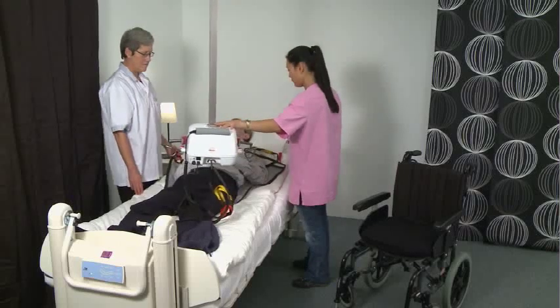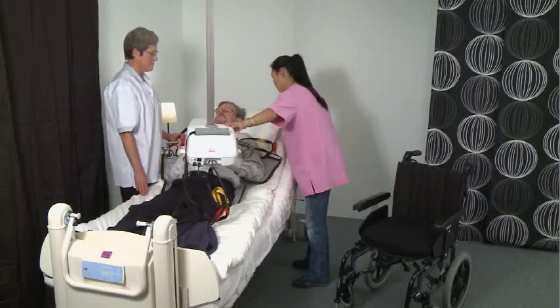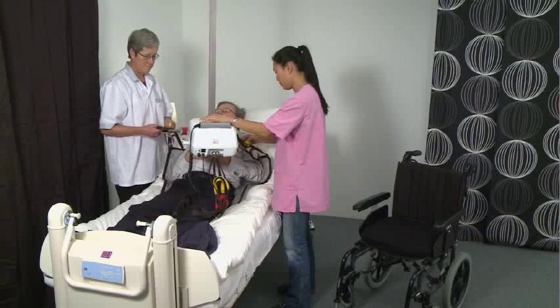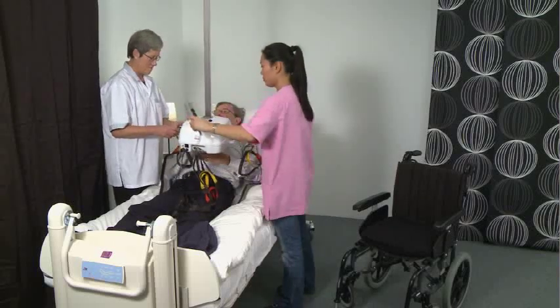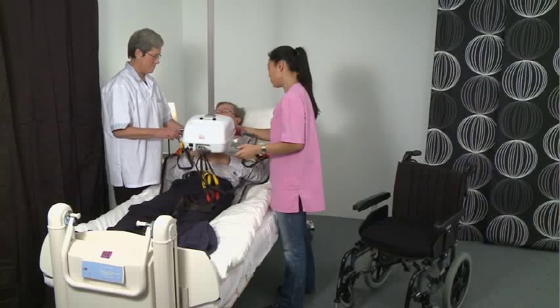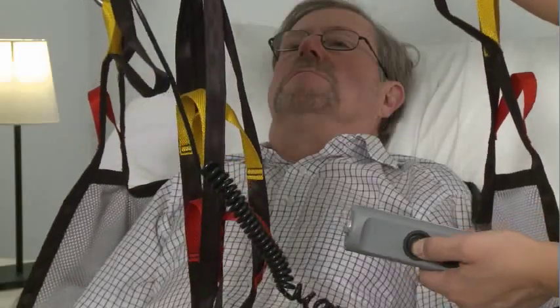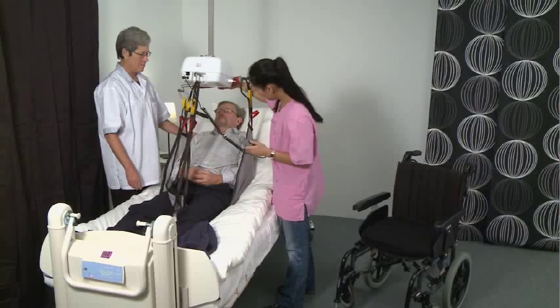Adjust the bed height and raise the bed's back support for a more comfortable lift. Hook the back harness strap loops into the corresponding hooks on the hoist unit. Hold the hoist unit away from the client's face while you gently raise it. Stop when the straps are tensioned and ensure that all the harness loops are secured on the unit's hooks.